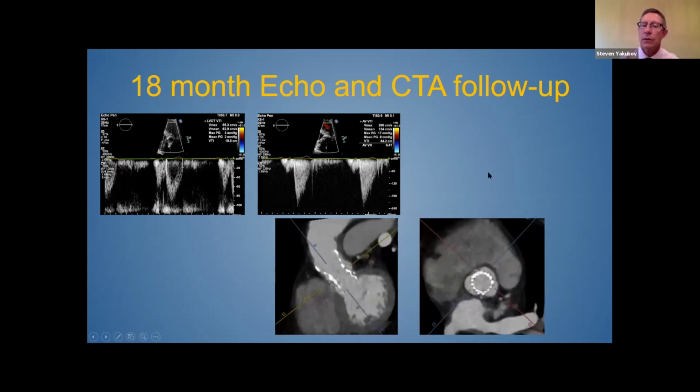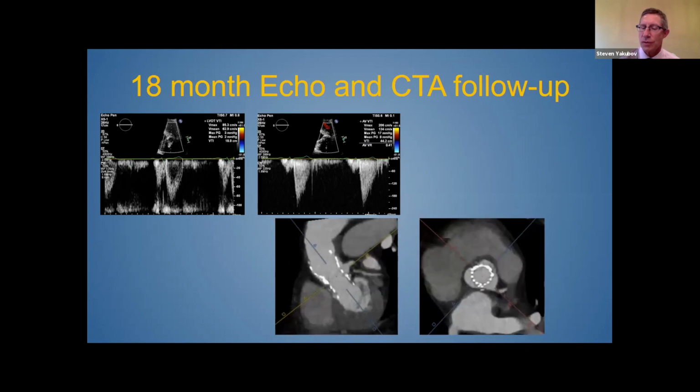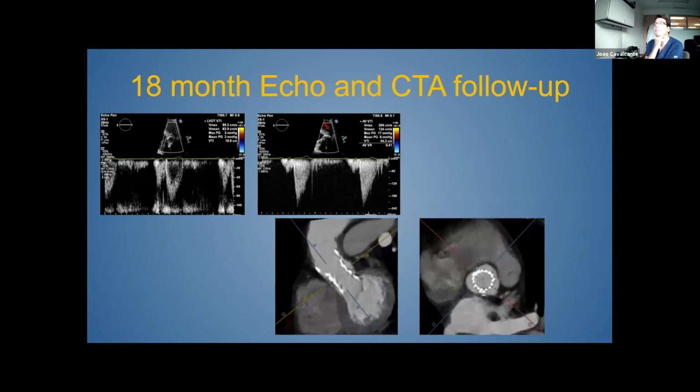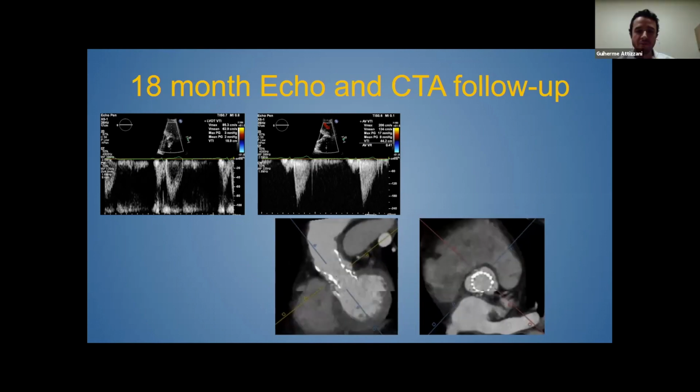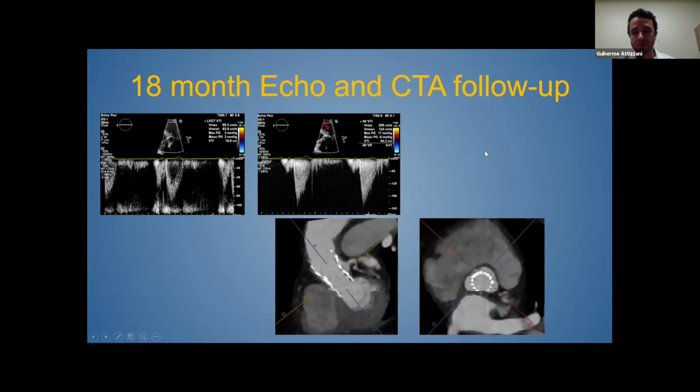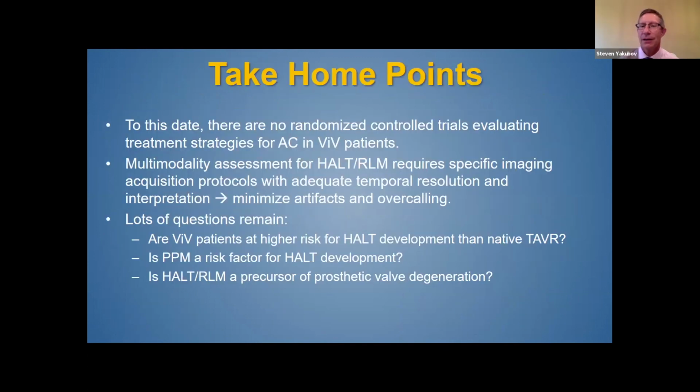Yes. So again, I'll come back to the question: should you anticoagulate valve-in-valve TAVR from the get-go? Yes. We have been giving 3 months of anticoagulation for our valve-in-valve TAVRs, as long as the bleeding risk is not high. It's a reasonable bleeding risk. So we have been giving it routinely. I understand that there's no strong evidence or no evidence at all behind that, but we have been doing that for valve-in-valve TAVRs. With Coumadin? With Coumadin.